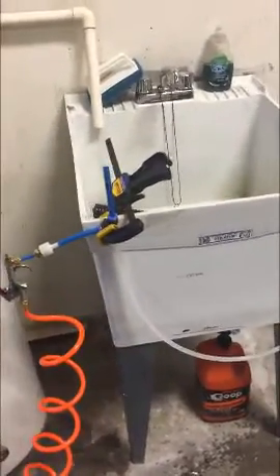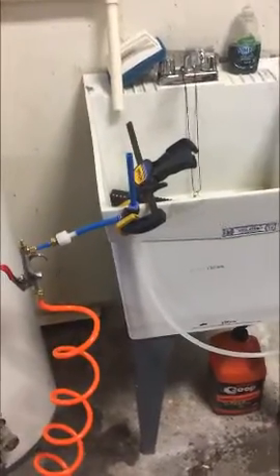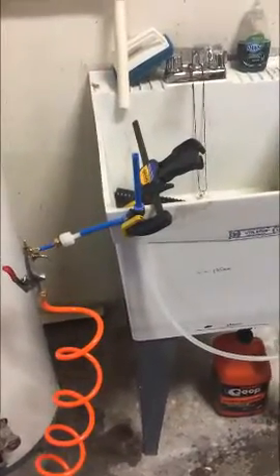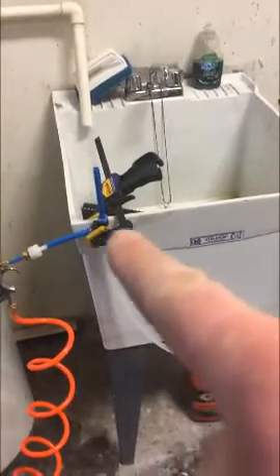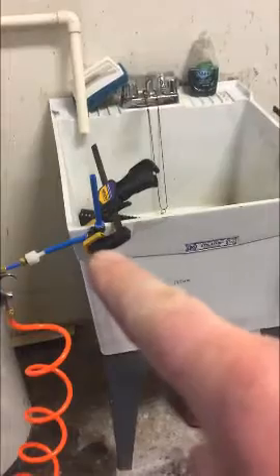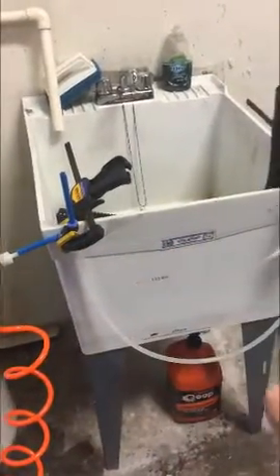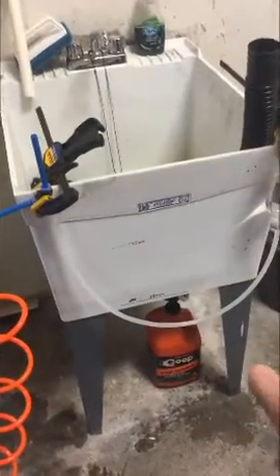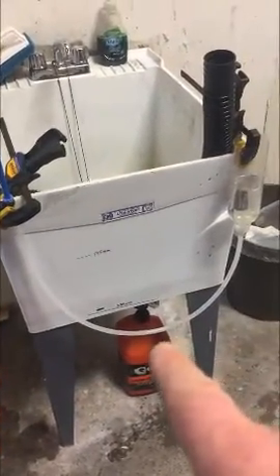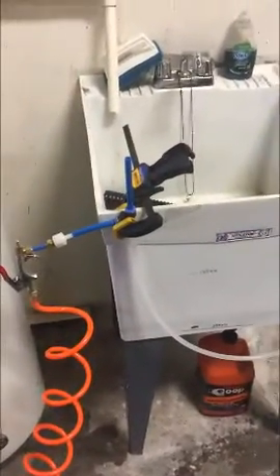When I put my mouth on this and breathe from it, what I find is that if I allow the air to flow into my throat easily, it will. If I apply resistance very quickly, because there's such a small volume of air in here, very quickly that air will pressurize, push the column down, and I will get up to 350 or, well, 400 millimeters of water pressure, forcing that air into my lungs.